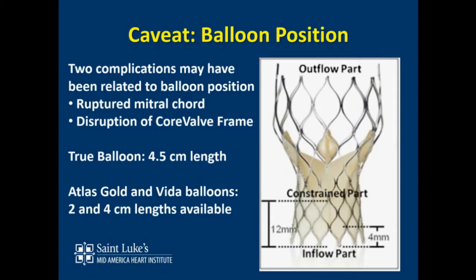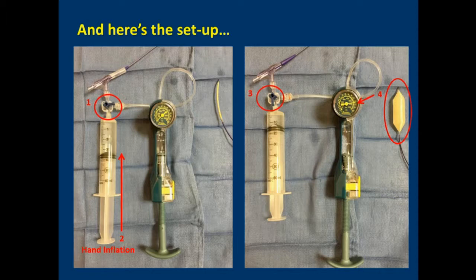And then how do you go down only with the big syringe? Yes. So what will happen is when the valve fractures, your inflator pressure will immediately drop to practically zero. Then you open the stopcock to the syringe and you go negative on the syringe to deflate the balloon. What are those types of pressures that you're getting? They're between 10 and 20 atmospheres.